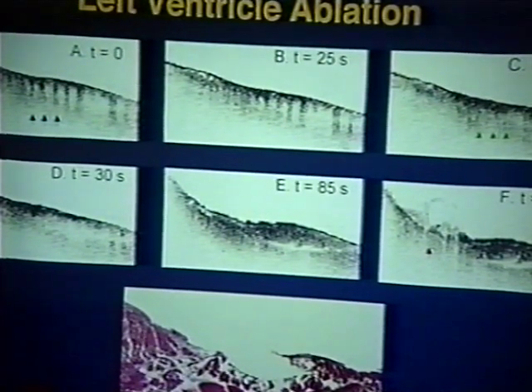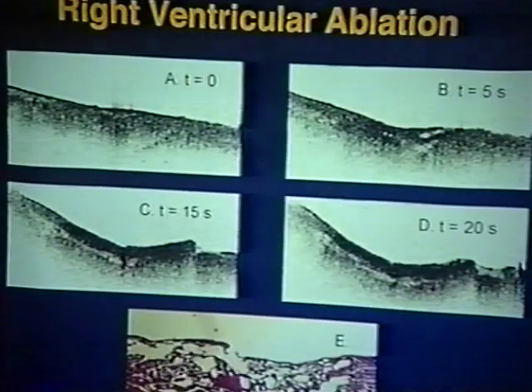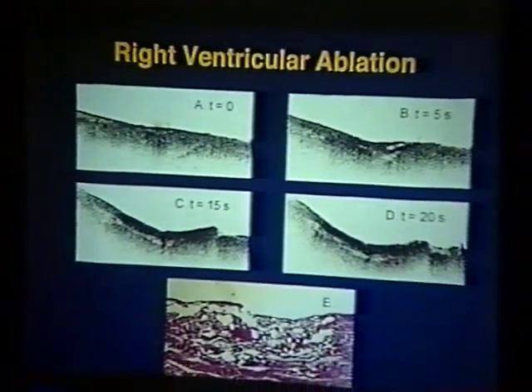So what we want to do, when you put these RF catheters, is to be able to determine how deeply it's occurring, but at the same time, determine if there's excess damage, which is a problem. If you cause too deep of a burn on the left side of the heart, you create a focus, which can lead to strokes in that patient. And current techniques are really not very reliable.